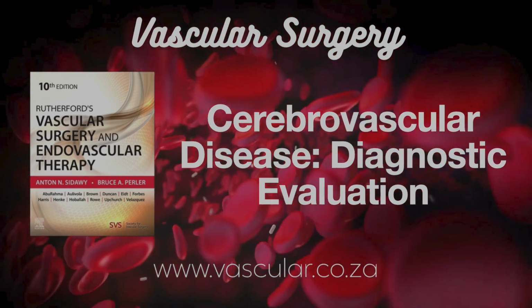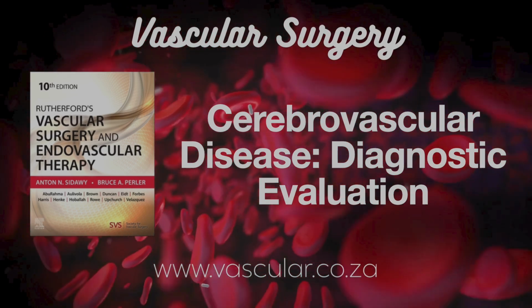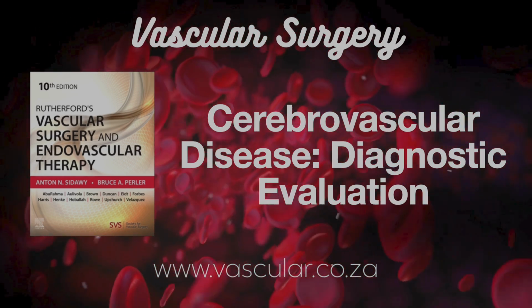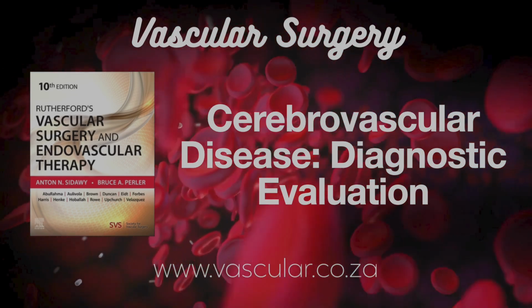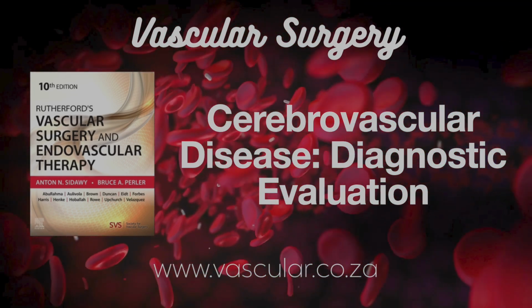What about after the procedure? Imaging right after surgery, or stenting? Well, during surgery, some centers use intraoperative DU right after closing the artery to check the repair. Look for any flap, clot, turbulent flow, but it can be technically tricky to get good images sometimes. What about after closing the patient up? Completion DSA isn't routine unless the surgeon has a specific concern about something further up.